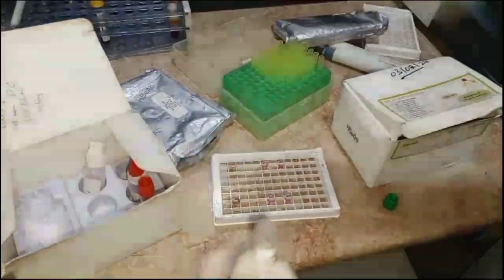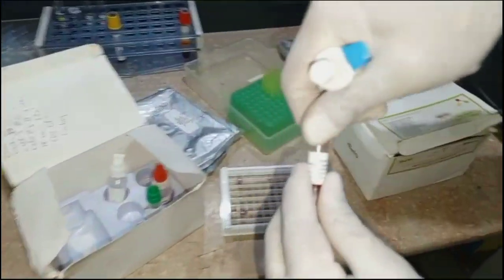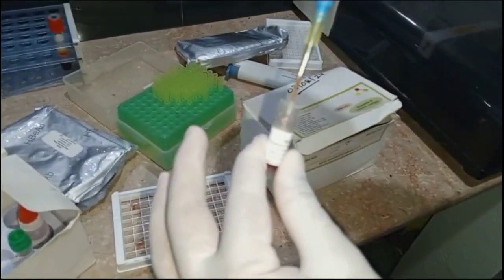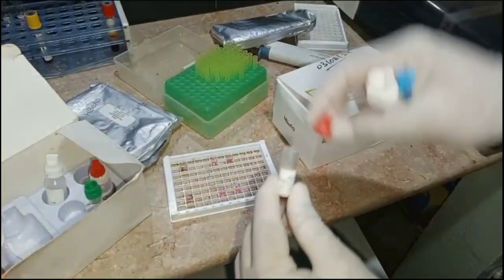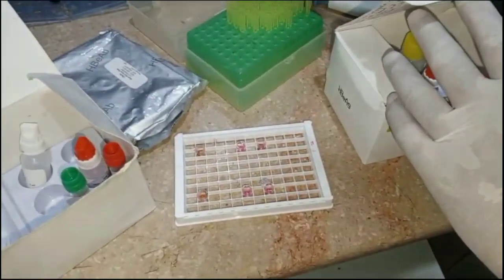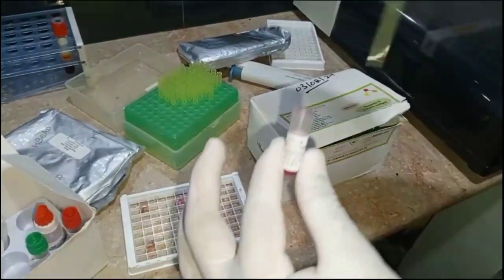The positive control will give the positive reaction, and the negative control will give the negative reaction. Similarly, in the third well we should add the negative control. When we get positive as a positive control and negative as a negative control, it means that the kit is okay and there is no problem, and the test that we performed is also okay. So this is the importance of the positive control and the negative control that we should perform with the test.